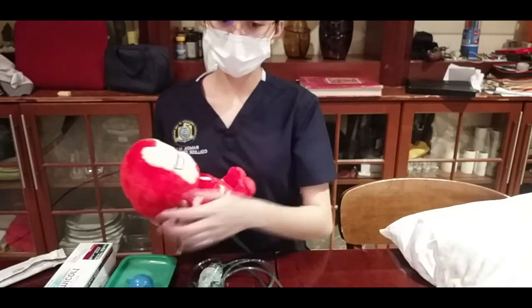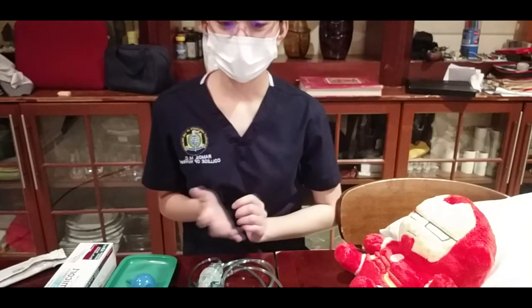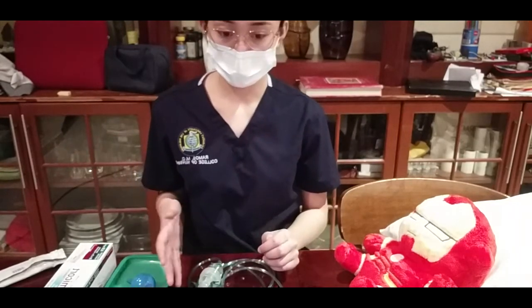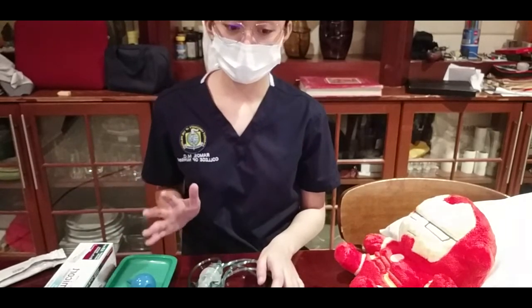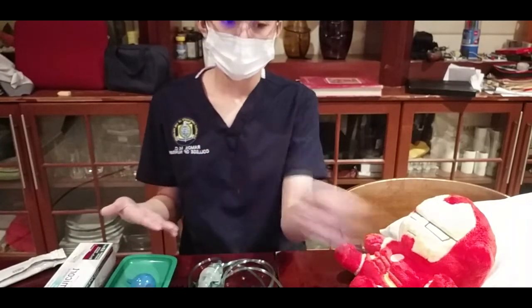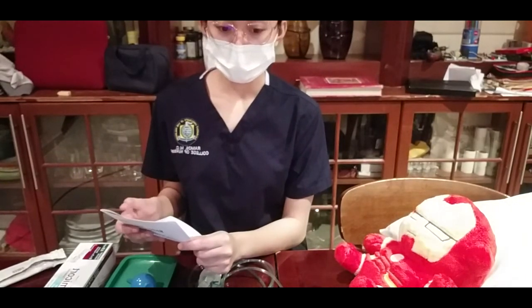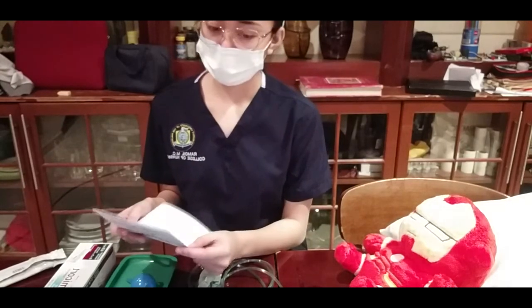So after suctioning the infant, I will also be checking the doctor's orders for oxygen, noting delivery method, flow rate, and duration of oxygen therapy. So I've already ensured safe and accurate oxygen administration is done by the doctor's orders. So pretending that I've already checked the doctor's orders, in need for oxygen therapy. Safe oxygen delivery includes the 6 rights of medication administration.